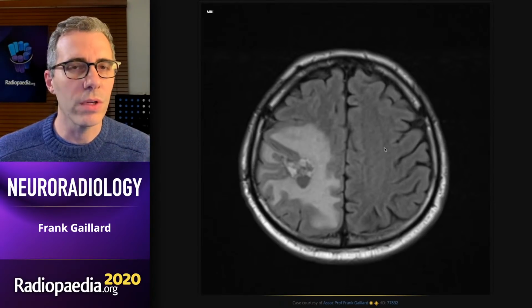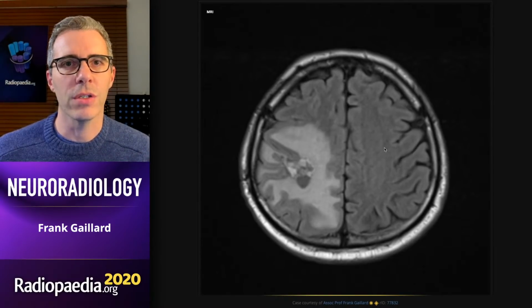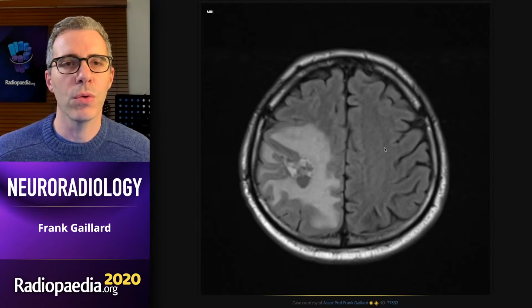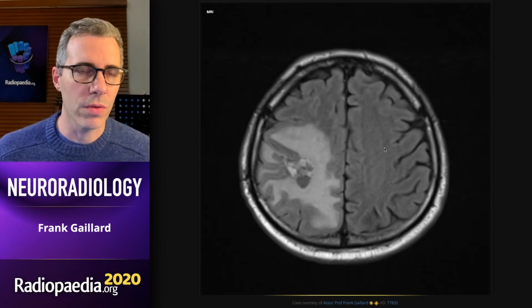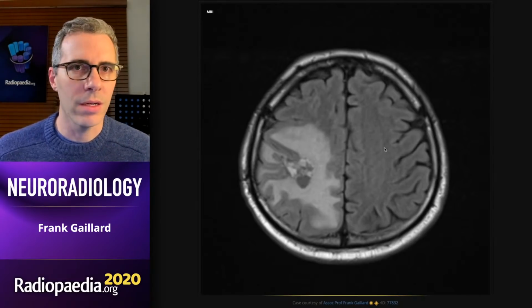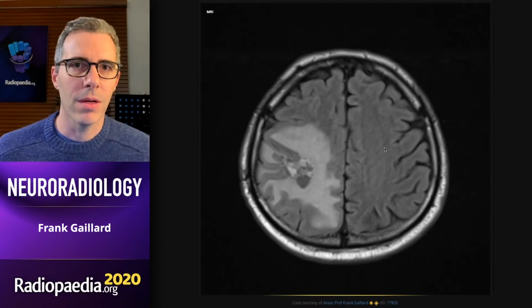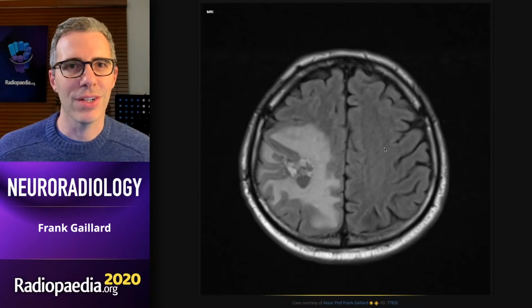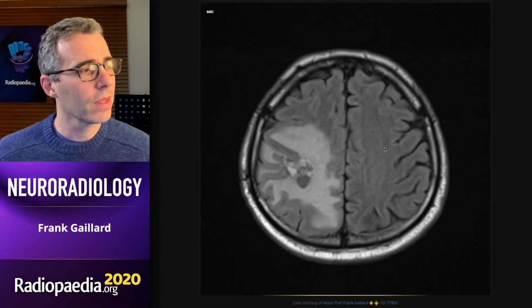Now, clinically, there's a really good clue, and that is that patients with pseudo-progression usually are much better than their scan. So if you get it wrong and you call it progression, and you give the oncologist or the surgeon a call and you say, oh, you know, looking terrible, they'll say, oh, that's bizarre. I saw them this morning. If you're late in reporting, I saw them this morning in outpatient clinic and they were fine. They're not on any steroids. They're doing well. So that's a really big clue.